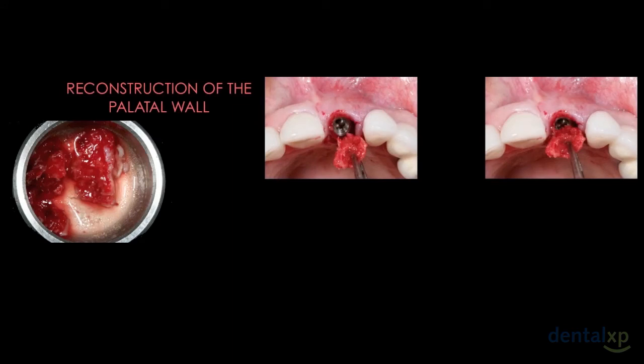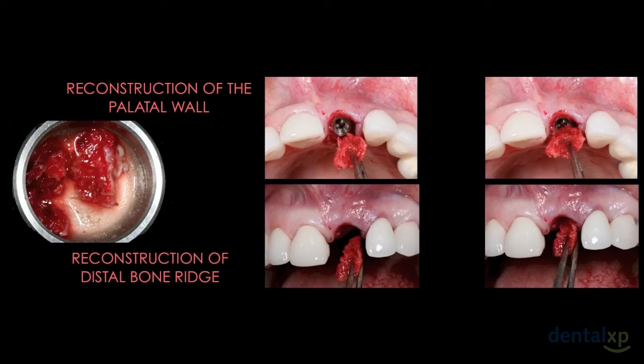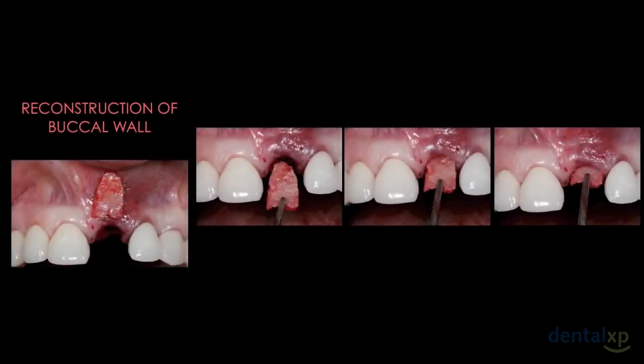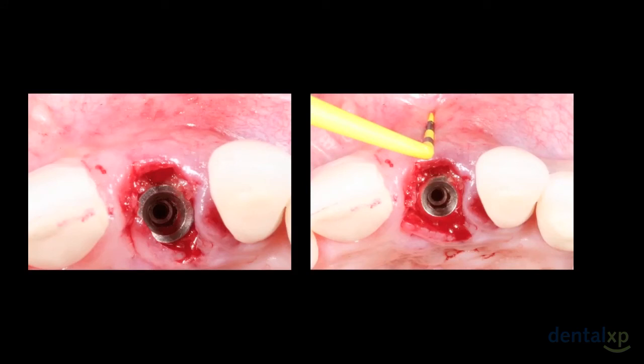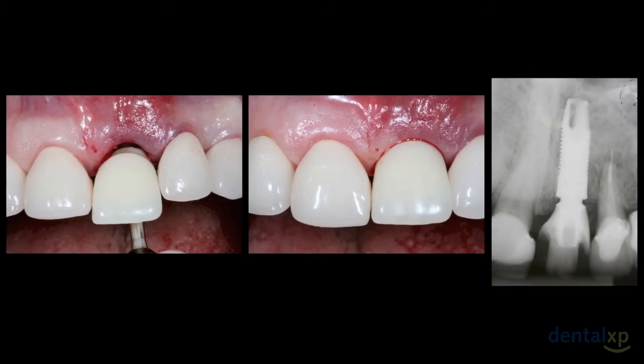We then start the reconstruction. Firstly, we reconstruct the palatal wall; after that, we reconstruct the distal bone bridge; and lastly, we reconstruct the buccal bone wall, as you can observe here. After total socket reconstruction, the provisional crown was inserted out of occlusion. The X-ray immediately after reconstruction shows the bone reconstructed at the distal aspect.